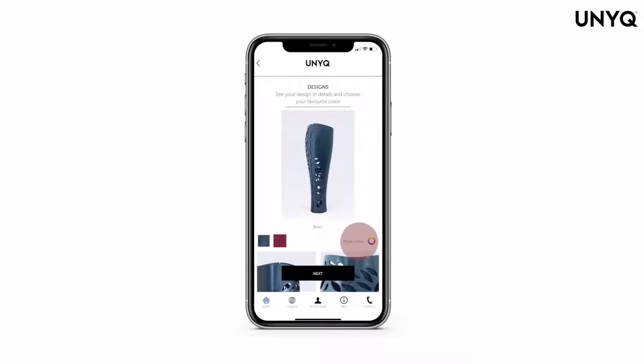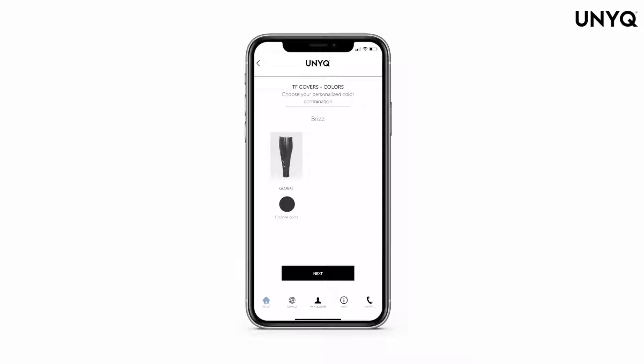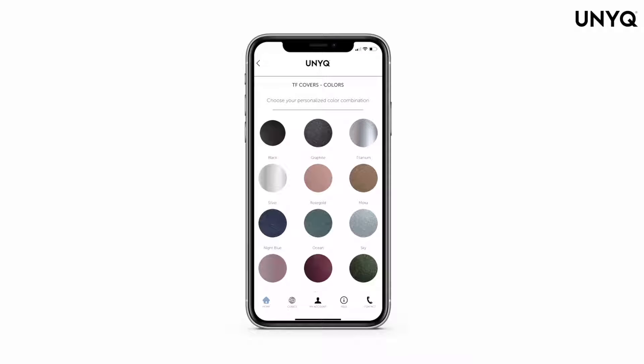There are ready-made combinations on show, but you have the option to select more colors and choose from a full color palette. Depending on the model of cover that you choose, you will have the option to select the color of the front or back part of the cover.